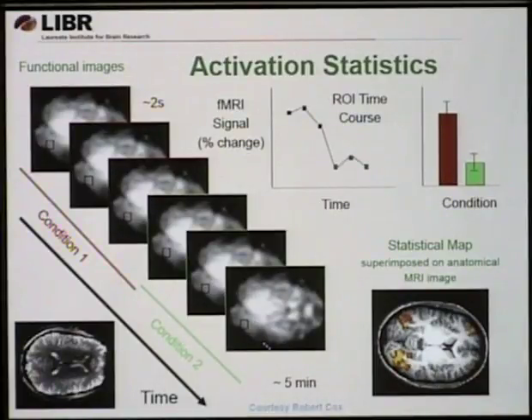Questions? Just quick, so in terms of generating the image on the bottom, do you do a slow scan to get that high resolution and then do the task? Actually, this is a structural image, which is independently acquired. Okay, so yes. But what I'd like to also point out here is that those images I acquired, say, 10 years ago.